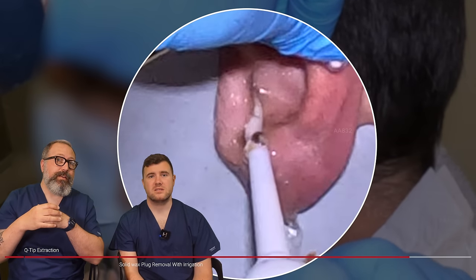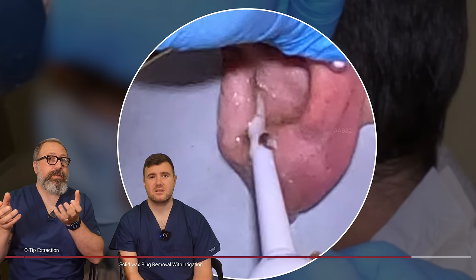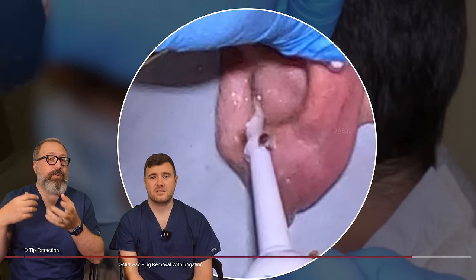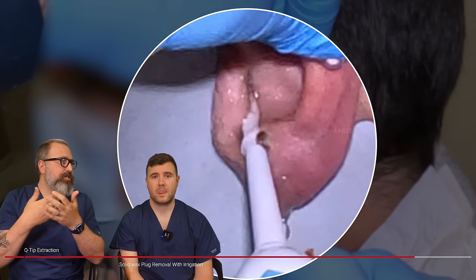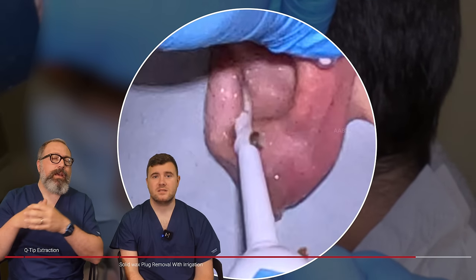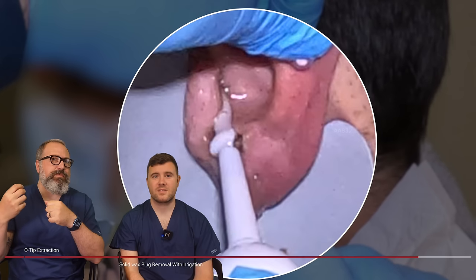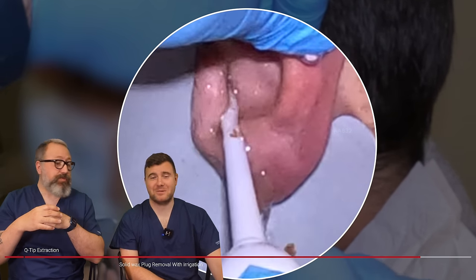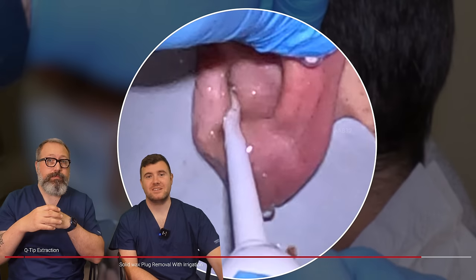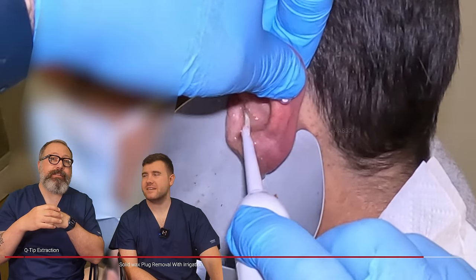You know, this doesn't hurt the patient — it's not uncomfortable. What you hear is a bit of a thumping sound because it doesn't go into a steady stream, it pulses a little bit. So you do hear a bit of a thumping sound. A patient will feel like a bumping sensation in the ear canal. Me and Taylor both tried it — I thought it was quite relaxing, to be fair. A lot of people do say it's quite relaxing, quite nice actually. It's like a little bath for your ear.